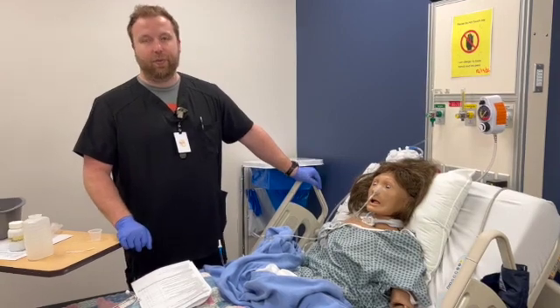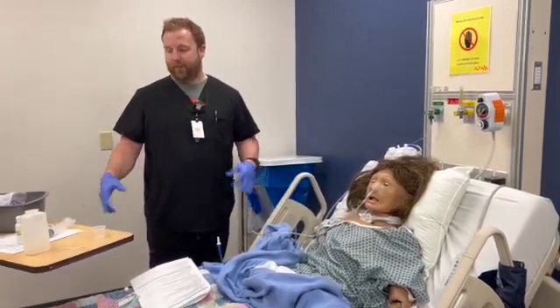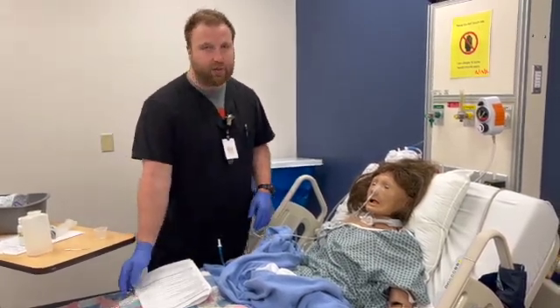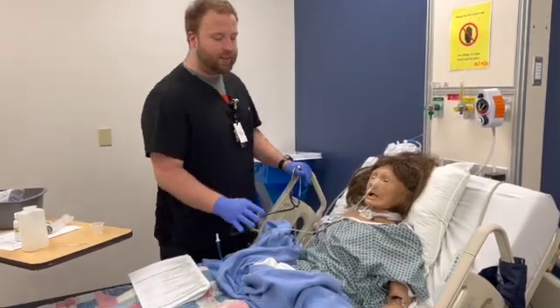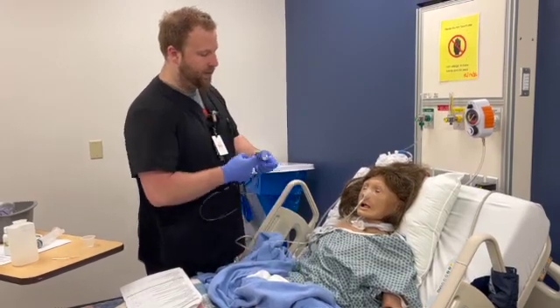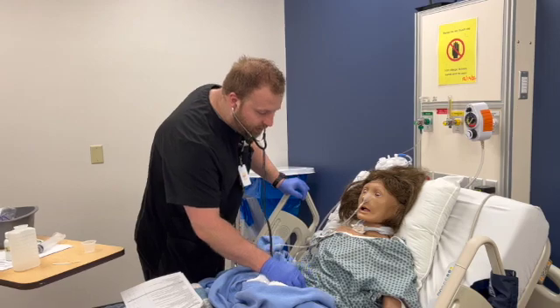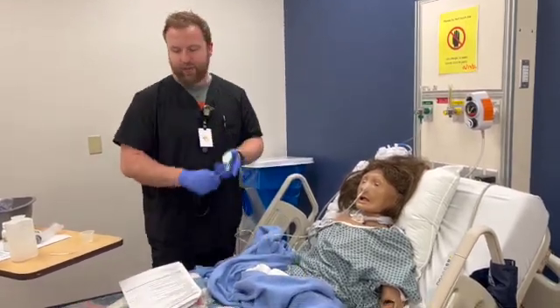Last thing that we're going to do is remove the NG tube. We're going to check for orders of the NG tube. We have orders that says remove them. I'm going to do my K-wipes. Another critical here, I want you to do my abdominal assessment. I want to make sure that there's no changes and the patient is not going bad on me. I will look. I'm going to listen and feel. This is a critical one. Make sure you don't miss this one.